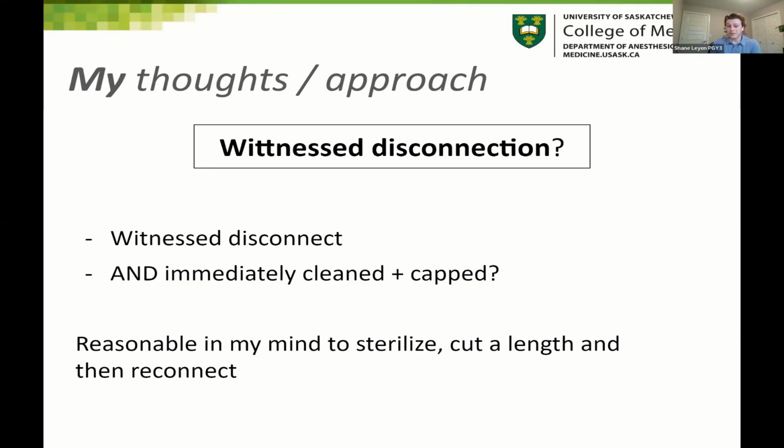If it's a witnessed disconnection, I think if it's immediately cleaned and capped, it's pretty reasonable in my mind to sterilize, cut a length, and then reconnect, or if we know it's been a very short amount of time, for example.